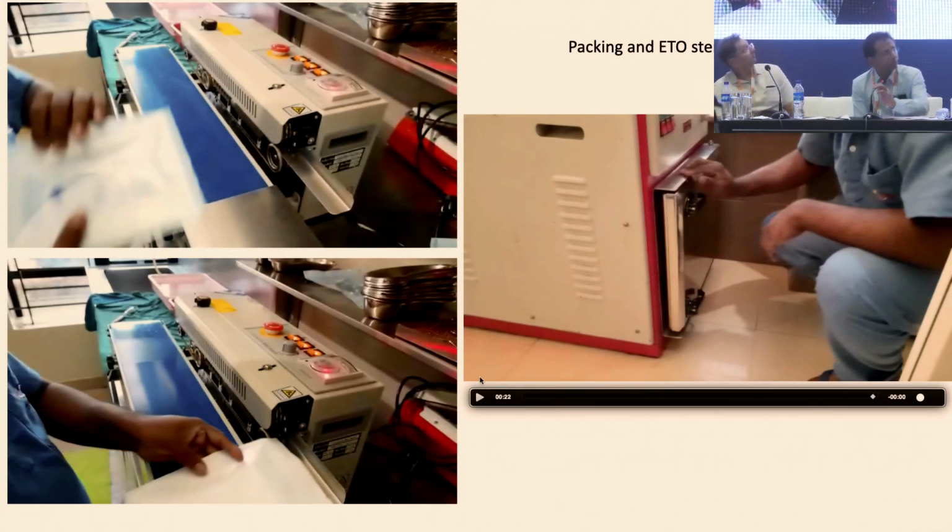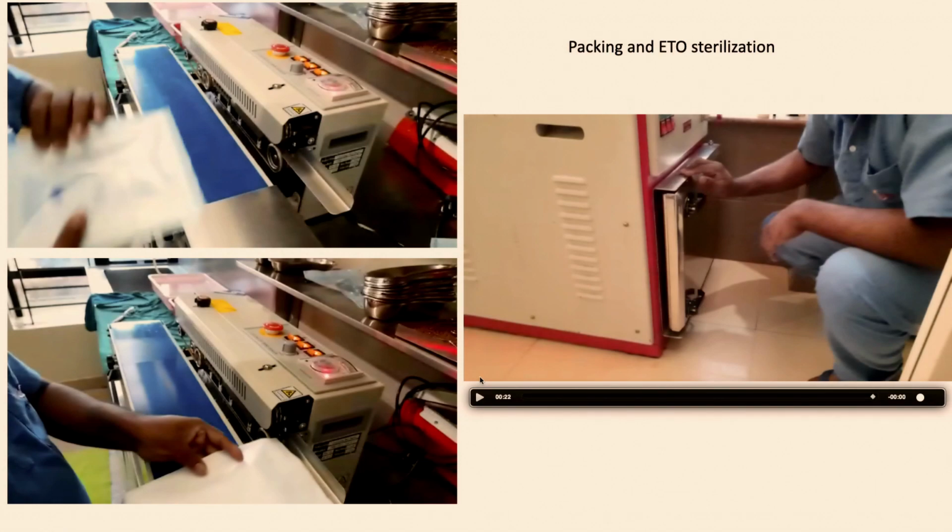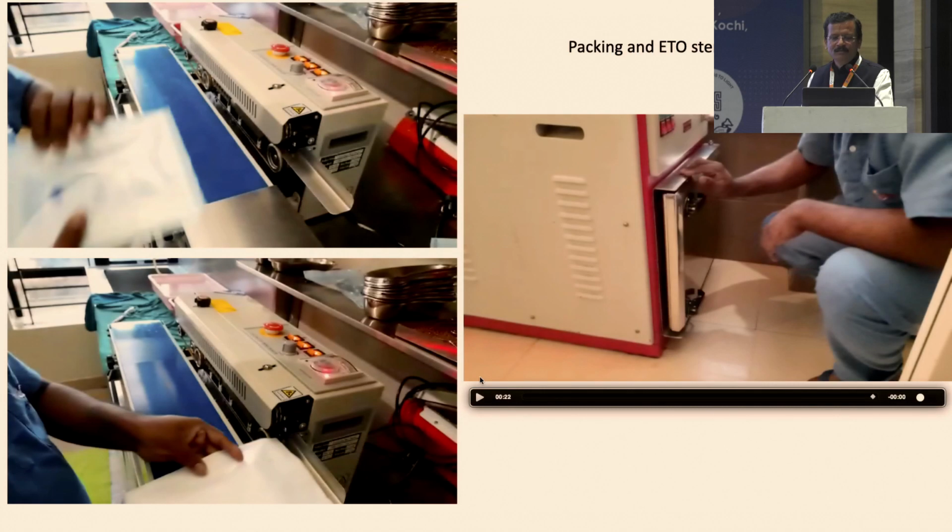Over to you, sir. Thank you, Dr. Megur, and thank you, Dr. Bharathi, for including me in this interesting IC. Mainly my topic is on standalone anterior vitrectomy, how to use it, and what are the troubleshooting, and also sterilization. I have added, there is a little bit overlap of the previous presentation also. So can we have the audio ready for you?